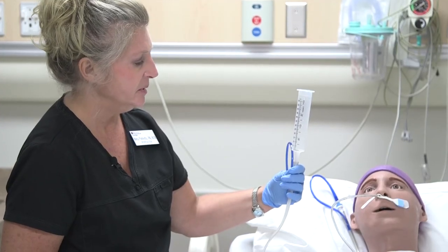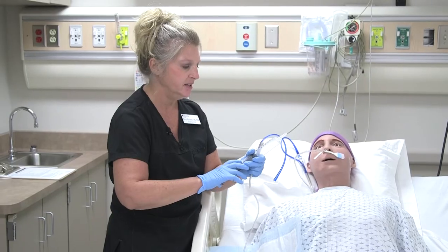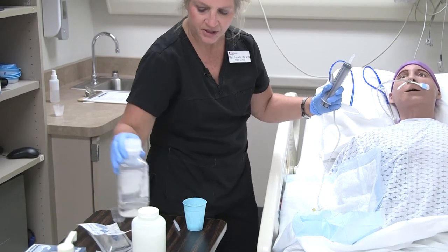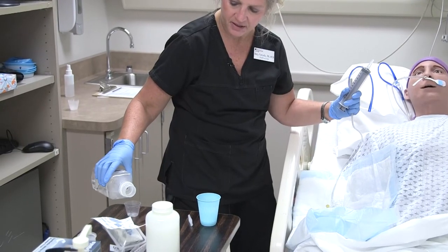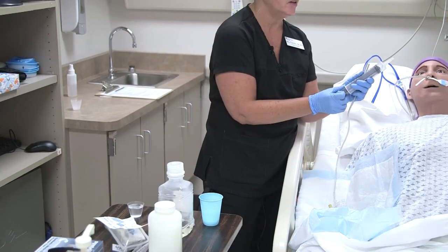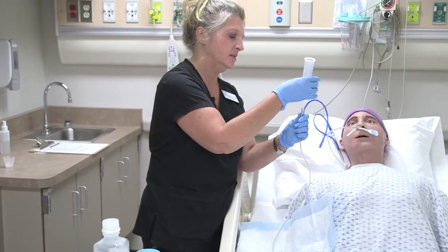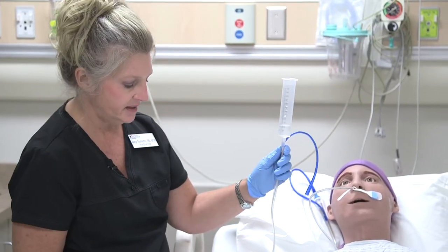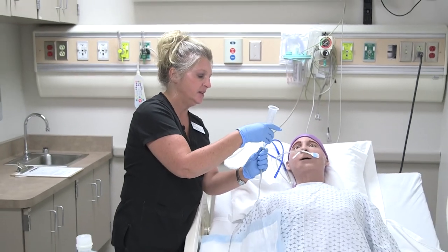When the feeding goes in, clamp the tube and take off the syringe. Then flush one more time after giving the feeding to keep the tube patent — always flush before and after administering anything. I'm flushing with 30 more cc's of sterile water, which can also be done by gravity. Now the flush is complete, so make sure it's clamped again.